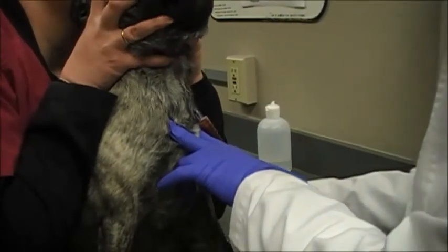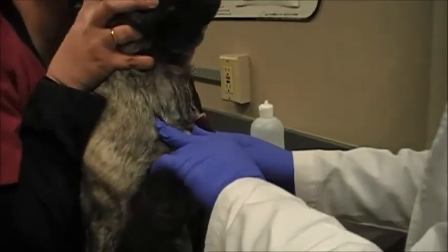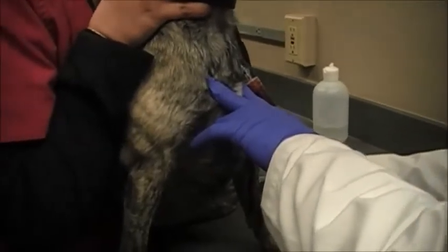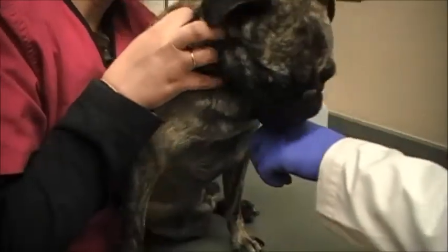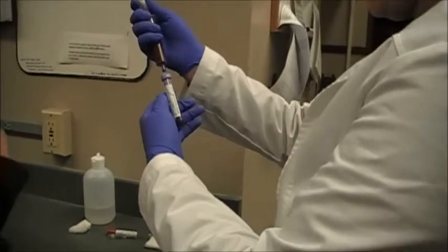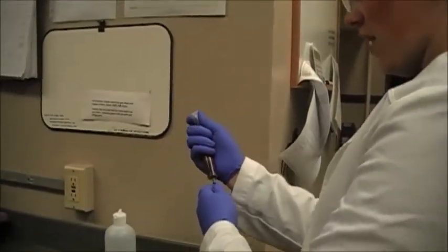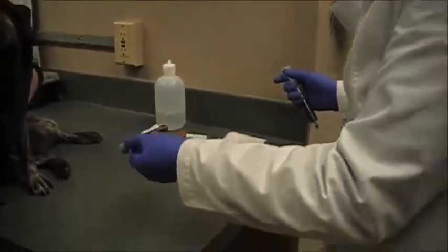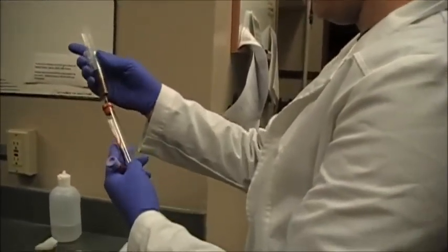It's almost done — almost done. I'm going to put it in my EDTA tube first, just pulling it in about to the bottom of the tag there. I'm going to gently mix that. I'm doing these two tubes. I'm not putting any pressure on the syringe, just letting the vacutainer pull it in.